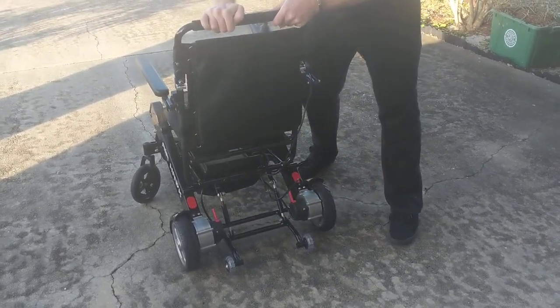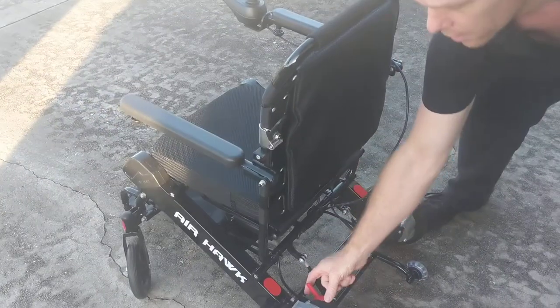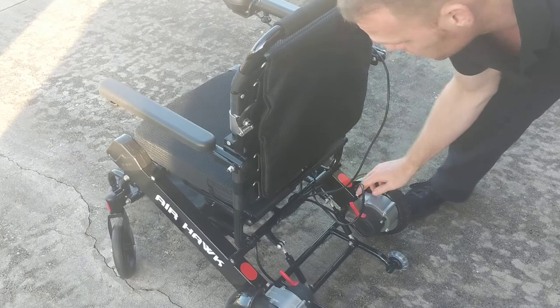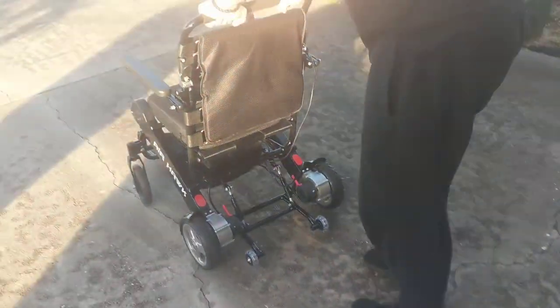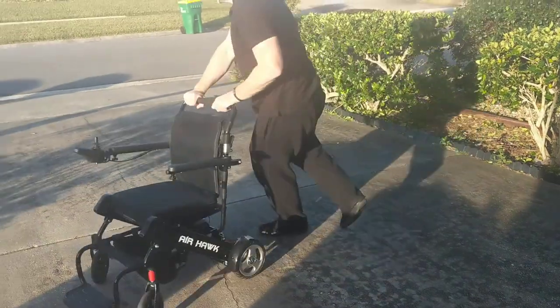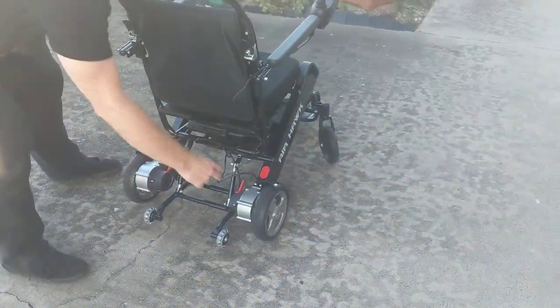Turn those back and we have effectively locked the chair. We push those forward — one wheel is unlocked, the other wheel is unlocked — and just like that we have a very effective manual chair.